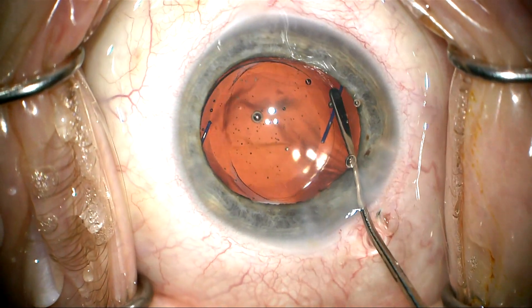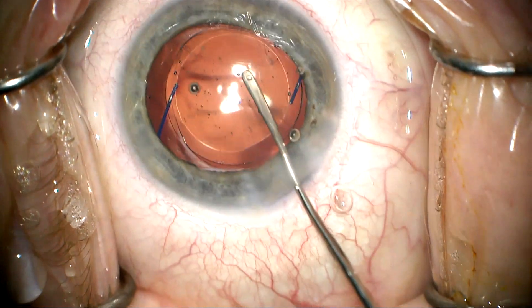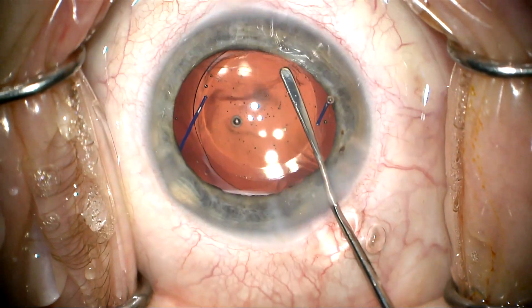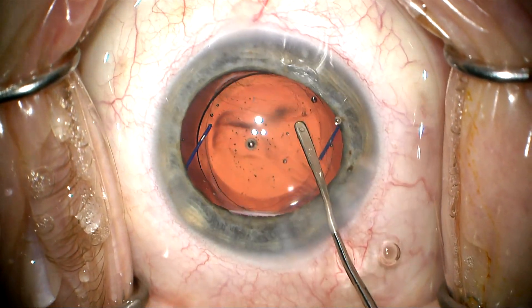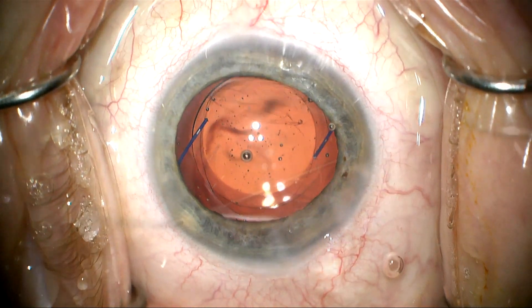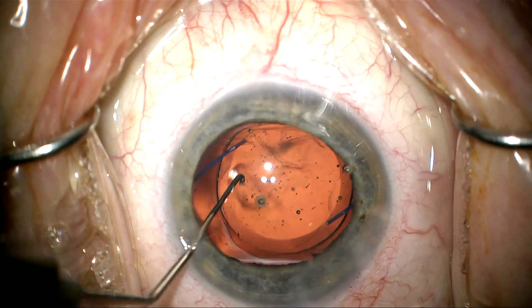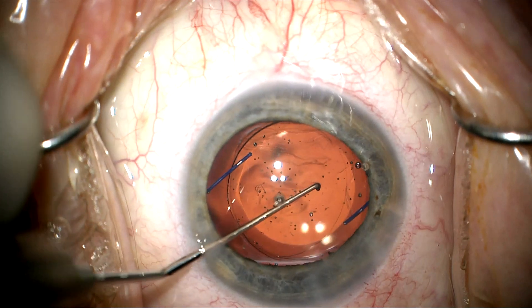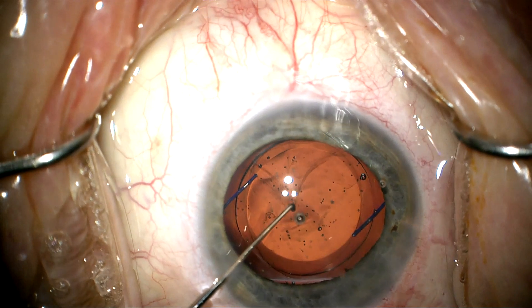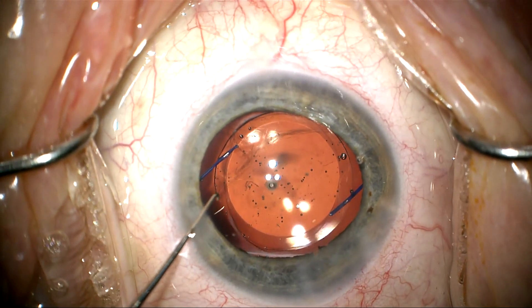I'm going to pull this over and center it, rotate a little bit and center it. I can see this floppy, redundant posterior capsule 180 degrees away from my incision, actually lying over the surface of the optic. As I rotate the lens a little bit, I can feel there's quite a bit of play here in the capsular bag, and I just don't feel like this lens is really that stable.